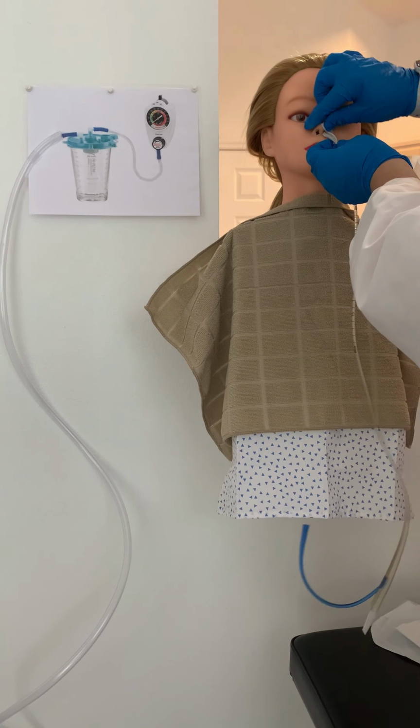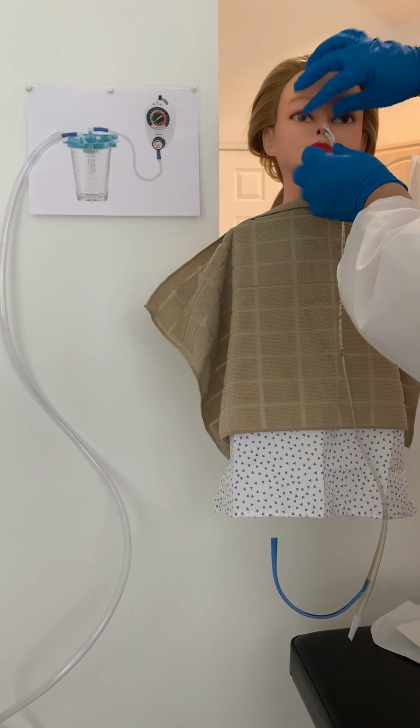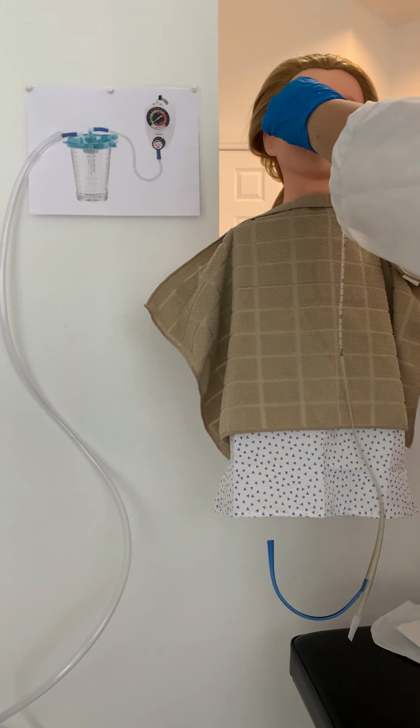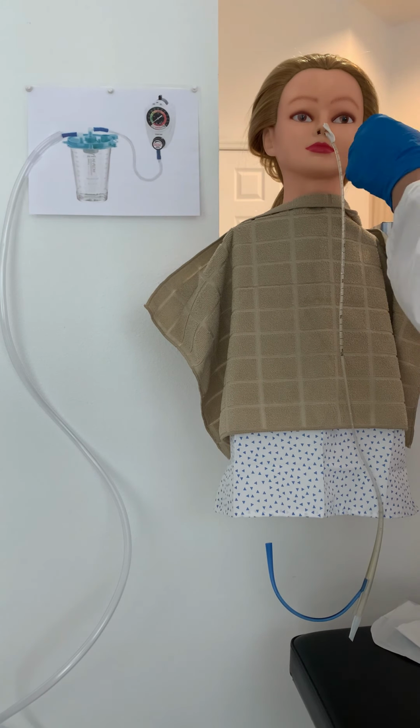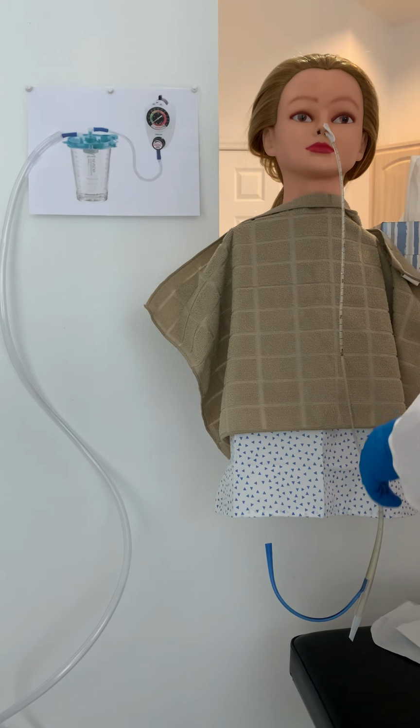If you're having any difficulty breathing, I would remove the tube. I'm just going to use that tape to hold it in place temporarily. And then if I were to have trouble getting that tube down, I would aim it downwards and toward the ear on the side that I'm going in.